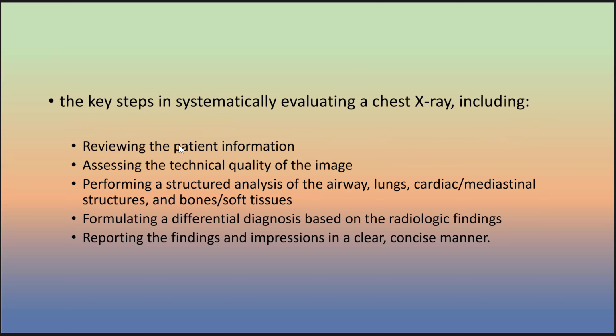As we said, he is reviewing the patient information, assessing the technical quality of the image, performing structural analysis of the airway, lungs, cardiac and mediastinum structures, and bones and soft tissue, and formulating a differential diagnosis based on radiological findings. Then, lastly, reporting the findings and the impression in a clear, concise manner.